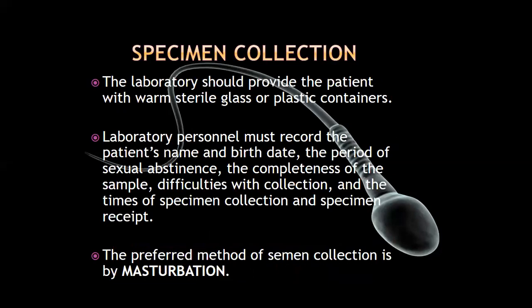Now, the laboratory should provide the patient with warm, sterile glass or plastic containers. During your laboratory exercise, you will be provided with sterile plastic containers with a cup. Take note that these containers must be sterile. That is to avoid contamination of the sample. Now, it is important to label the container with the following details.